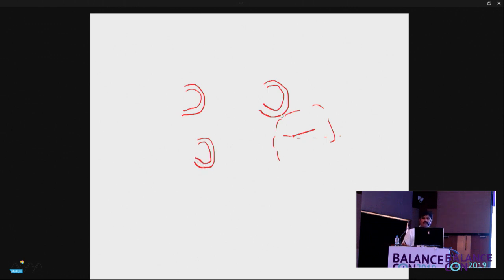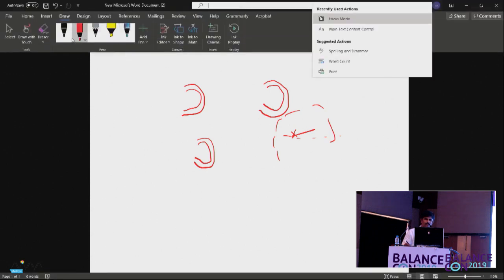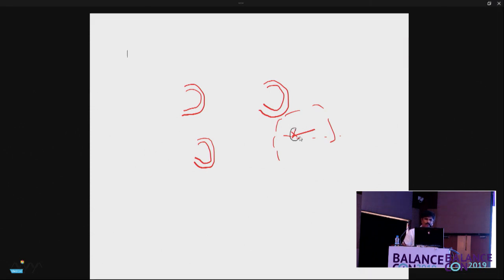fine. This particular place, the posterior end of the horizontal canal, will correspond to this part. Correct? Yes or no? That is the posterior most part. And when you know this anatomy, you know the most dependent part in this horizontal semicircular canal will be this part. Correct? This is higher up, because they are all front. The most dependent part is this part. Correct? You are all together?